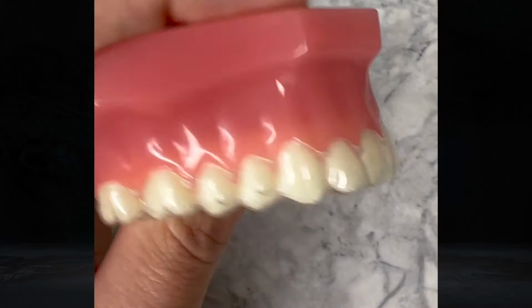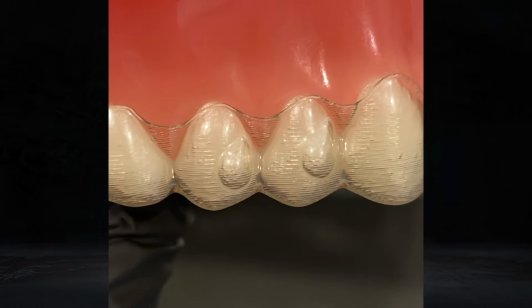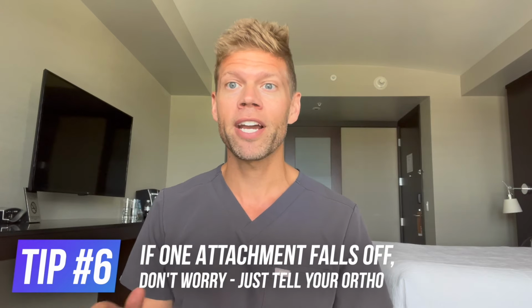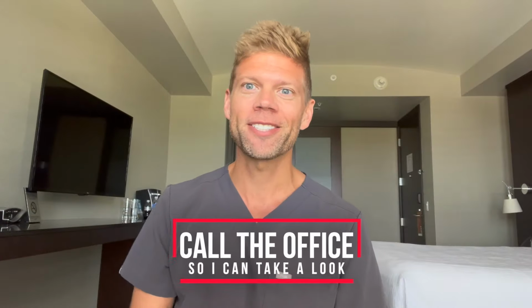Another thing you should know is that there are attachments on some of your teeth. What these are are tooth-colored bumps that create handles on the teeth so that we can move your teeth more efficiently and effectively during your time in aligners. Personally, what I tell my patients is if one of these attachments falls off between visits, I'm okay with that. Just let me know at the next visit and I'll let you know if we need to put it back on. Now, if all of the attachments start falling off, please call the office so I can take a look.